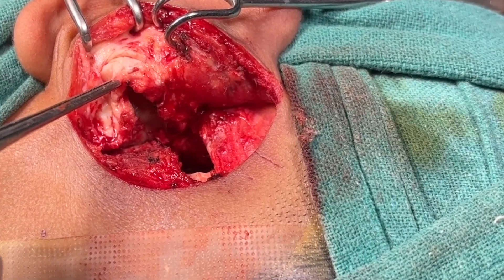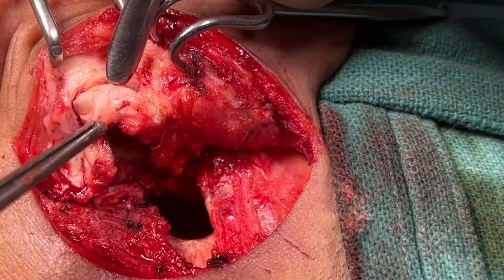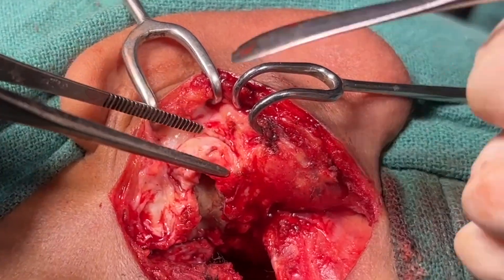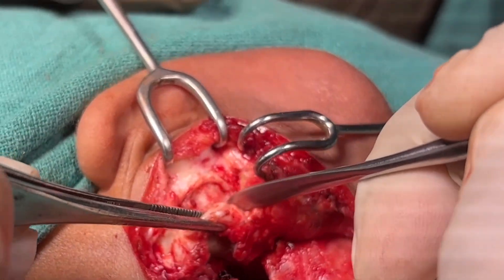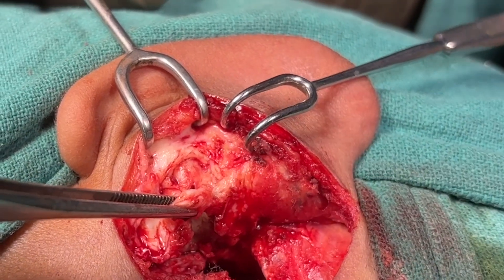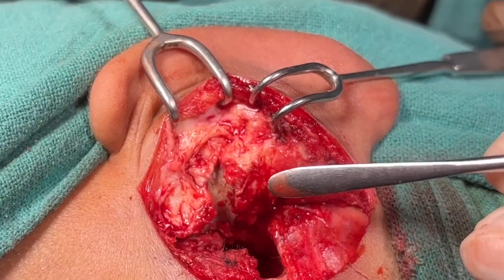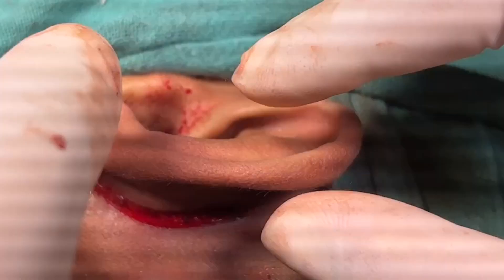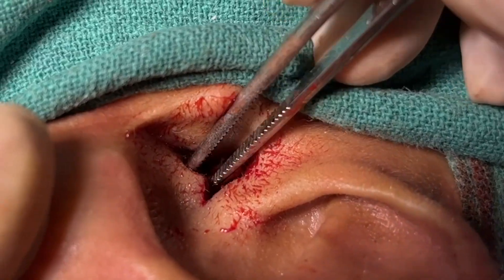Once the incision is made completely into the cartilage, I will be using a Freer elevator to dissect out the cartilage from the skin. You can use a non-toothed forceps to hold the cartilage and then carefully dissect out the cartilage from the skin. This way I have removed a piece of concheal cartilage and now the meatal opening will be wider. This can be checked by inserting your index finger from the meatus.